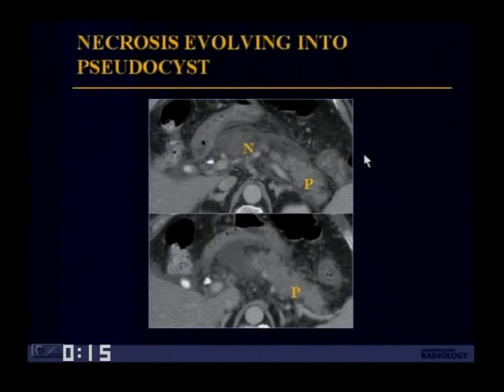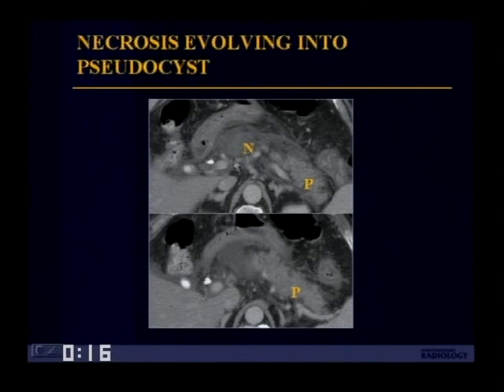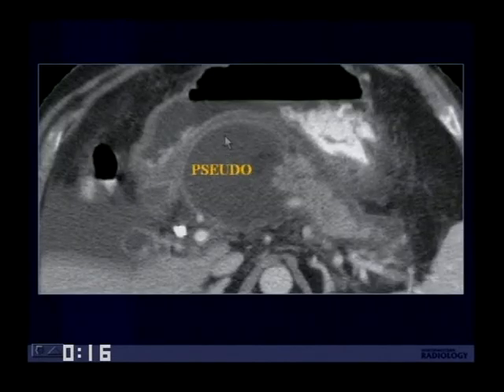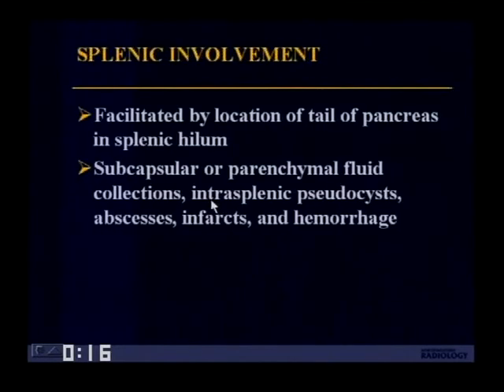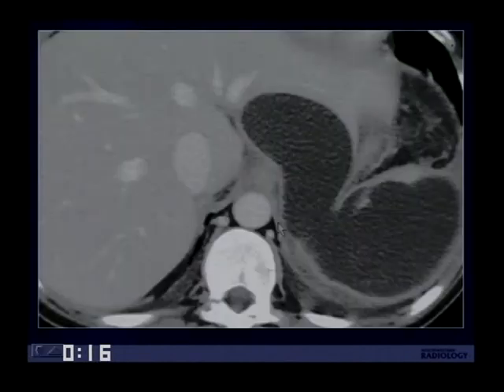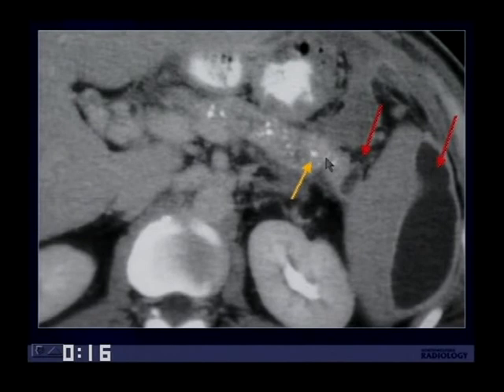Dr. Balthazar and others feel that many pseudocysts are a result of necrosis, either detected or not. Over the course of several weeks, an area of necrosis can develop into a pseudocyst, replacing the pancreas. Splenic involvement is often seen with acute pancreatitis due to the location of the pancreas near the splenic hilum — you can see subcapsular parenchymal fluid collections, pseudocysts, abscesses, infarcts, and hemorrhage. Here's an example of a large fluid collection dissecting into the splenic bed, and another patient with chronic pancreatitis with calcifications showing a small pseudocyst and perisplenic fluid collection.